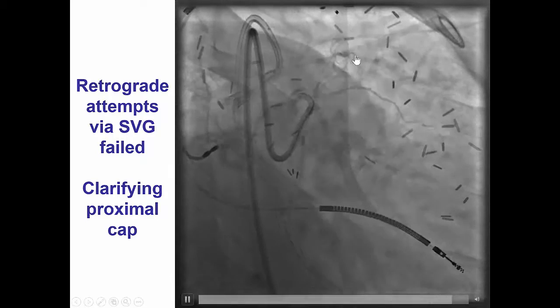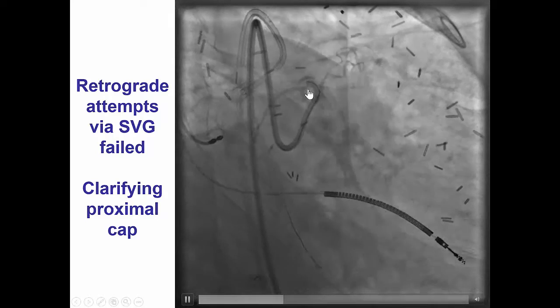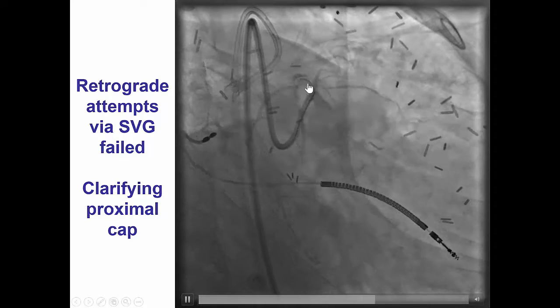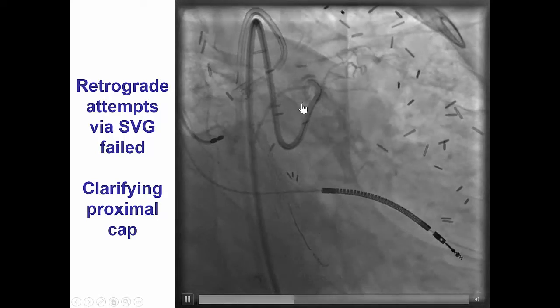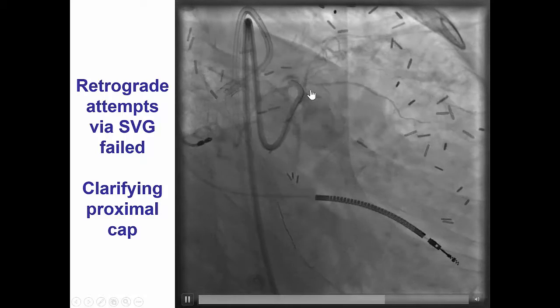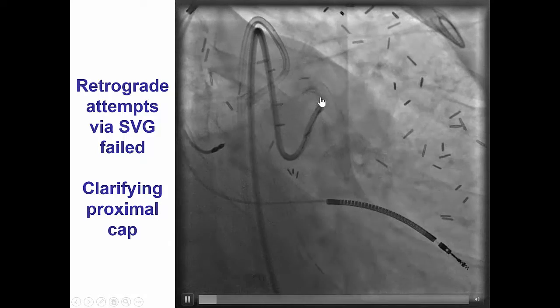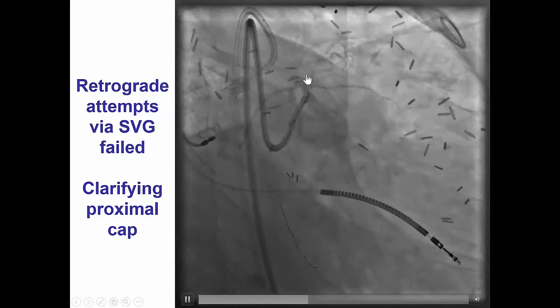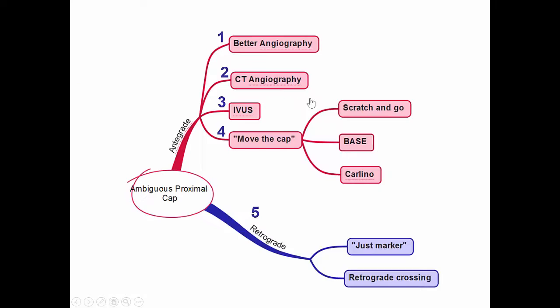The maneuver we chose is the scratch and go maneuver. We advanced a stiff guidewire proximal to the proximal cap and caused a small dissection, as can be seen in this view. This is an example of the scratch and go technique, one of the techniques that can be used to resolve proximal cap ambiguity.